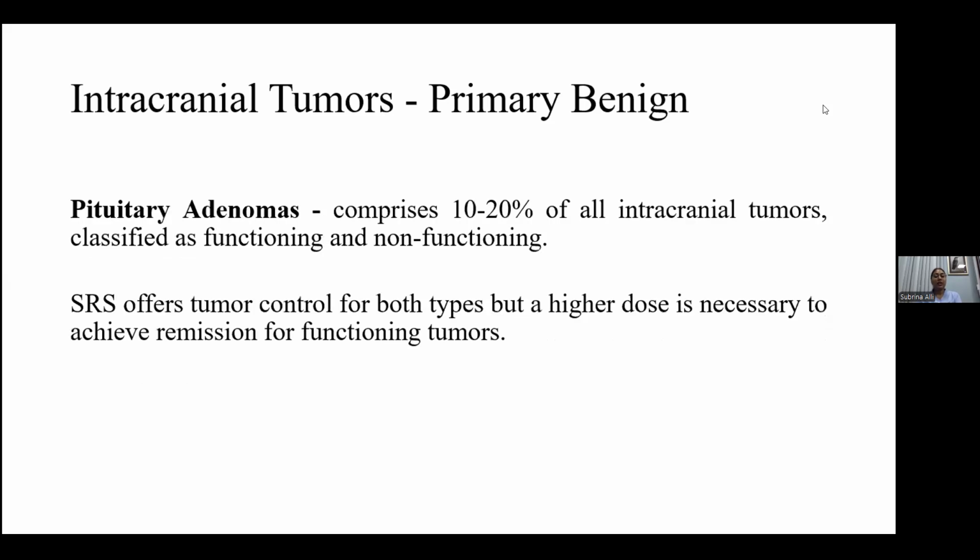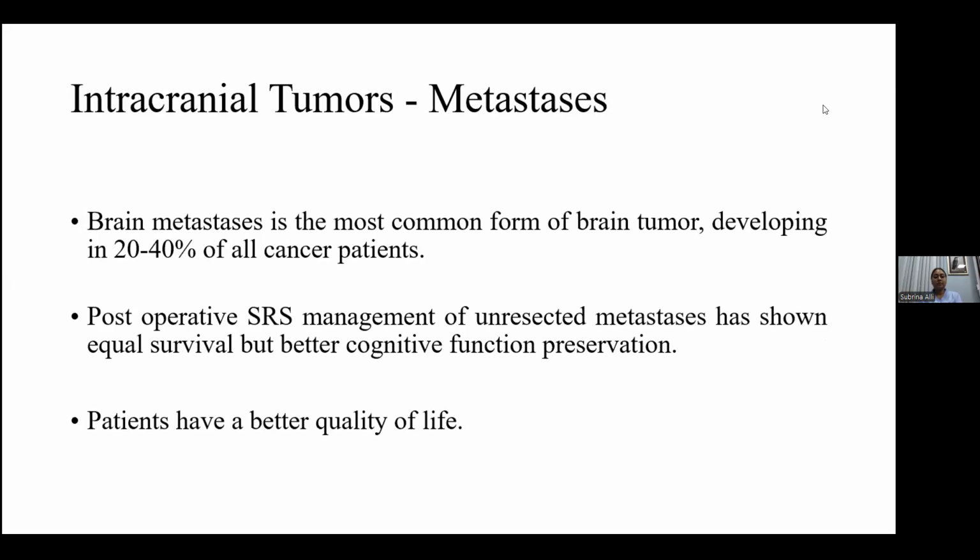For our pituitary adenomas, which comprise at least 10 to 20% of all of our intracranial tumors, we know they are classified into functioning and non-functioning. With respect to stereotactic radiosurgery, it offers tumor control for both types. However, we do see a higher dose of radiation being necessary to achieve remission for the functioning tumors.